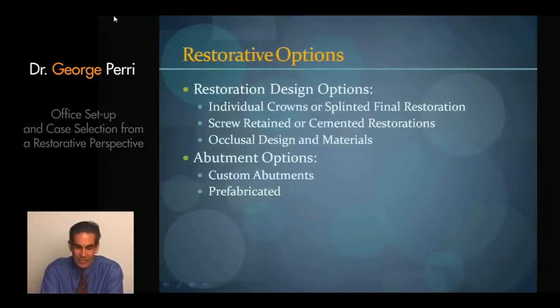There's certain standards in terms of occlusal design and materials that we need to look at, but basically there's a lot of options and a lot of ways that we can restore any given case. When I do restorative lectures, probably the most difficult thing for the person listening to the lecture is to grasp all the abutment options.